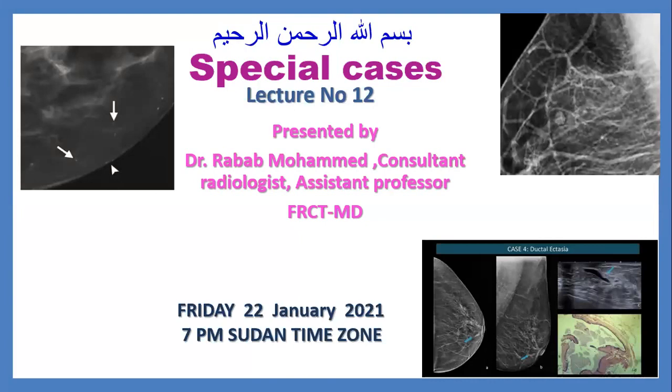There is an example of the special cases presented here in the first page. You can see it now. They are the intramammary lymph node. Intramammary lymph node. Yes. You are welcome.